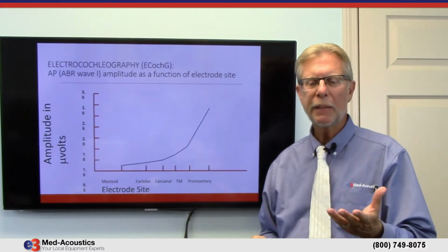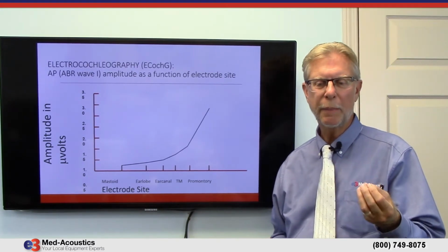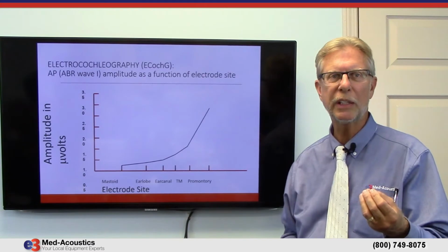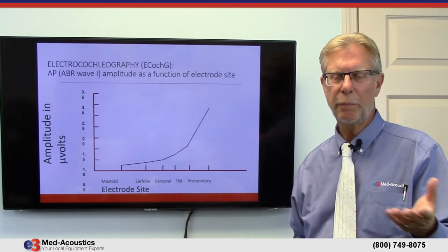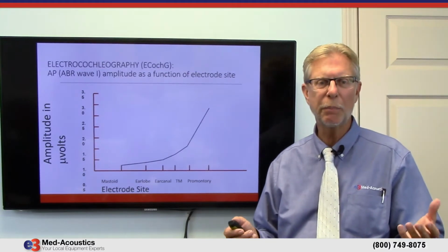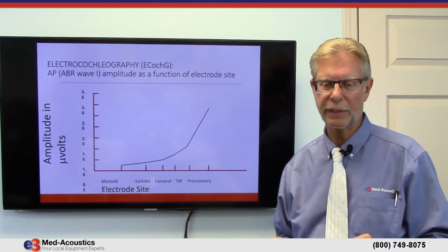So the first thing that students have to learn about this, since they'll be doing most of their patients with tiptrodes, is that you're using the smaller tiptrode, the one that you would normally use on pediatrics. In most cases, you're using that so that you can place it very, very deep in the ear canal.